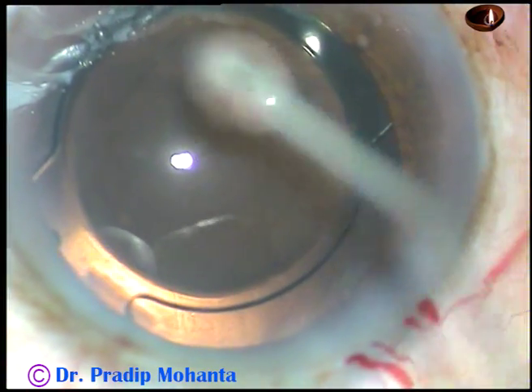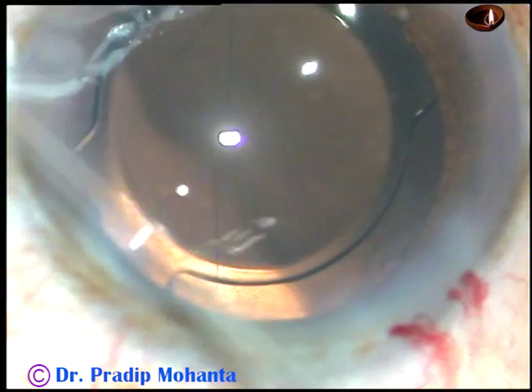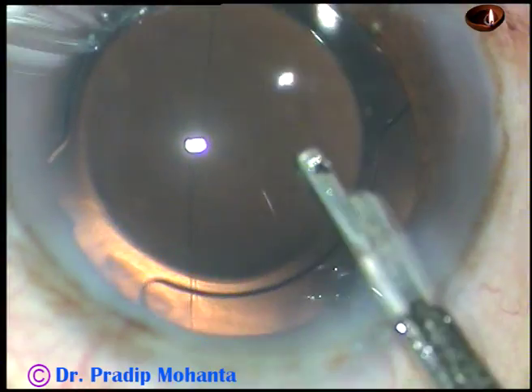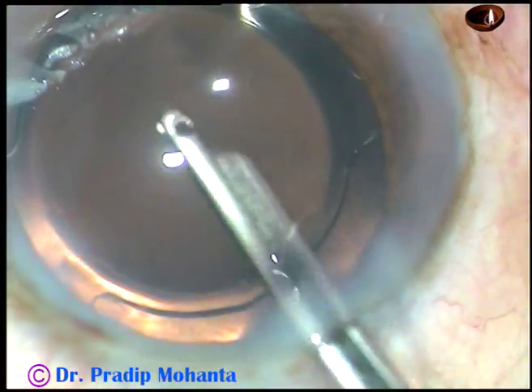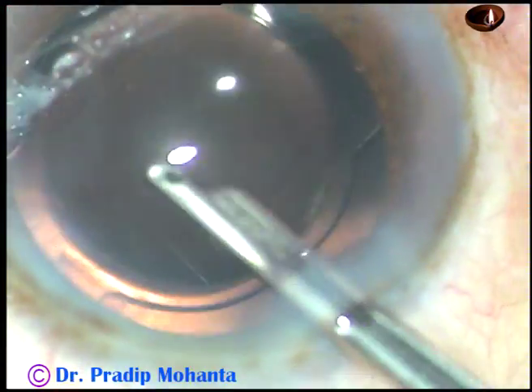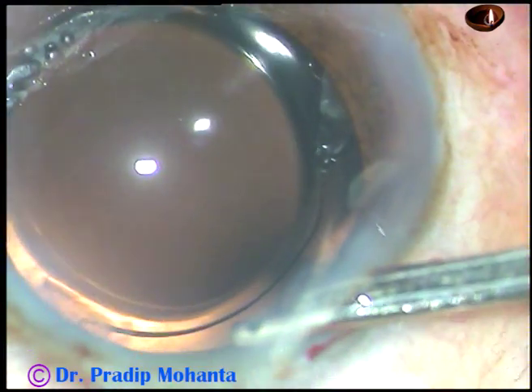Now the side ports are being hydrated so that these step wounds become watertight. We are towards the end of the surgery. This is a final lavage of the anterior chamber — at this time, whatever viscoelastic substance sticks to the corneal endothelium comes out. Now you form the anterior chamber nicely and conclude the case.